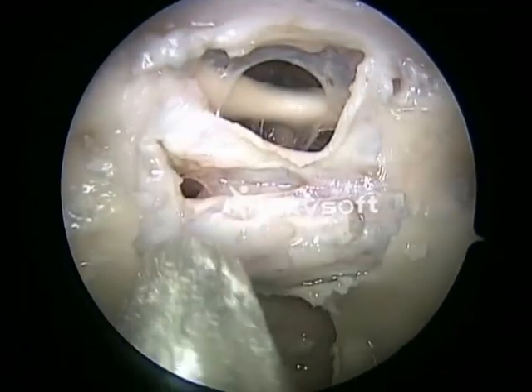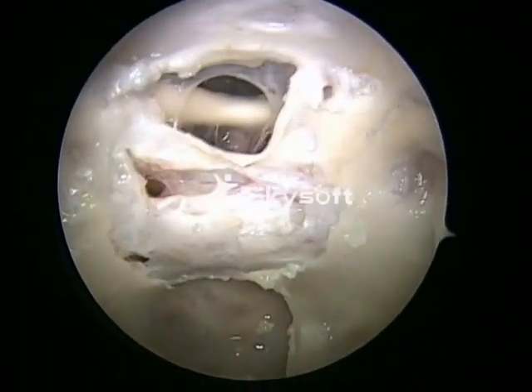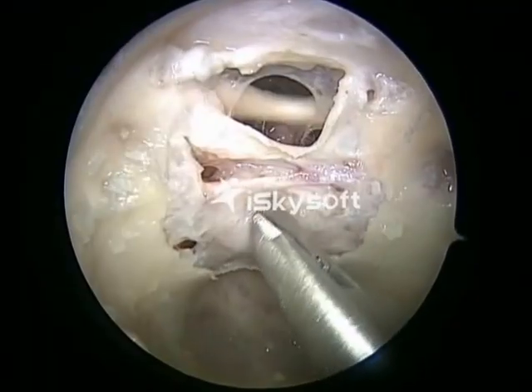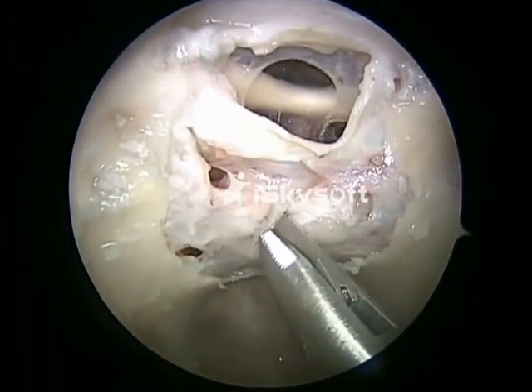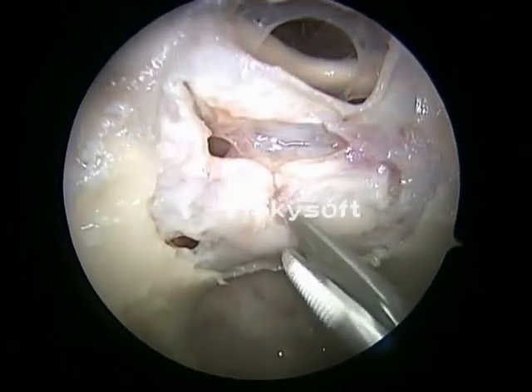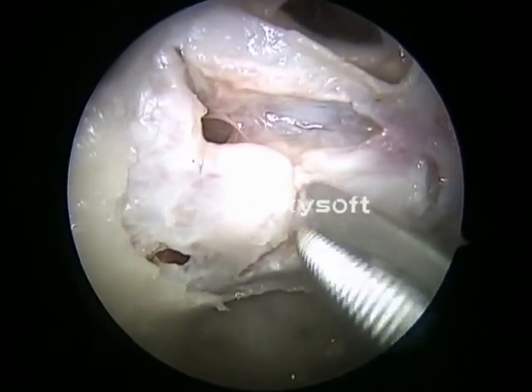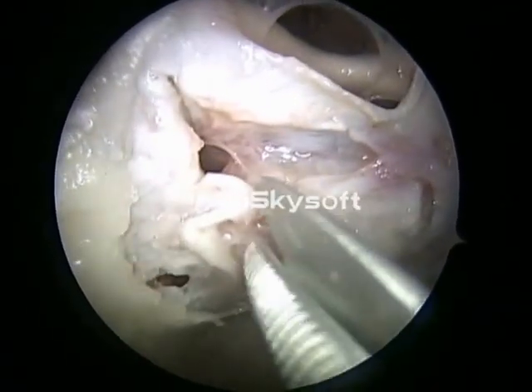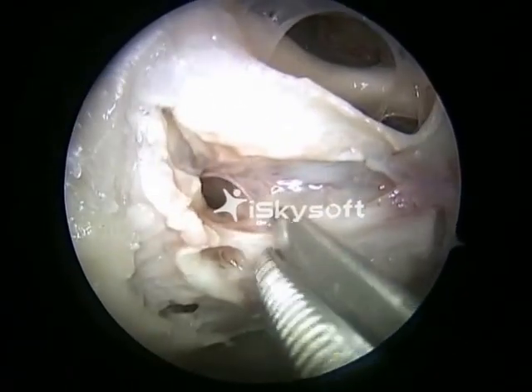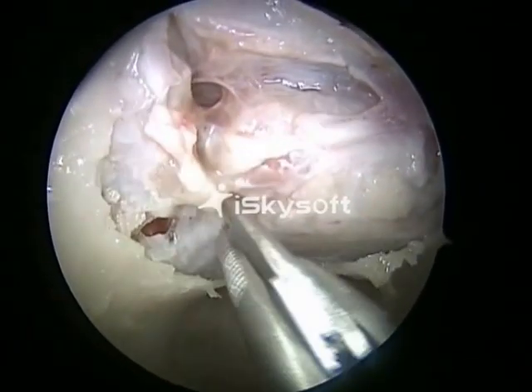The next exercise would be a pituitary transposition. This exercise and technique has been described by Professor Amin Kassam and colleagues from the Pittsburgh University. This is done for retrosellar lesions and tumors involving the interpeduncular fossa. The dura is elevated from the pituitary gland and a subdural dissection is done.